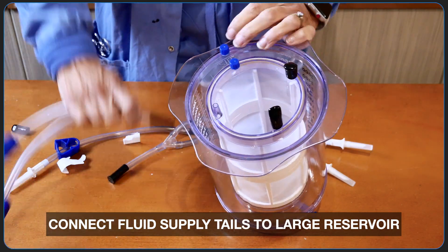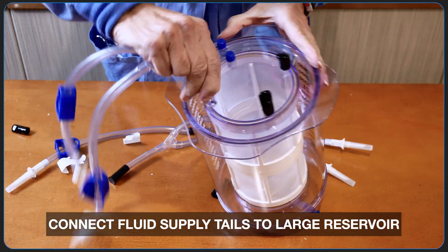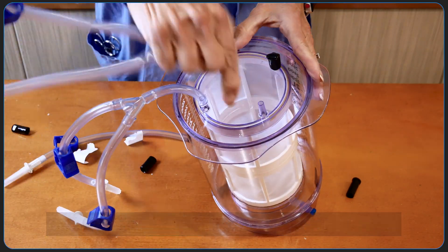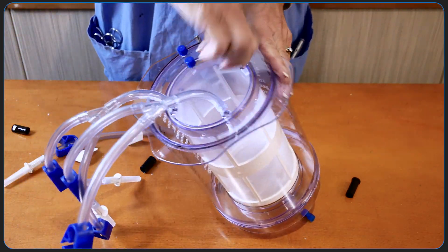At the top of the reservoir, there are 3 connections for 3 fluid supply tails. All in all, you can attach 5 distinct infusions in total to the 3 fluid supply tails.